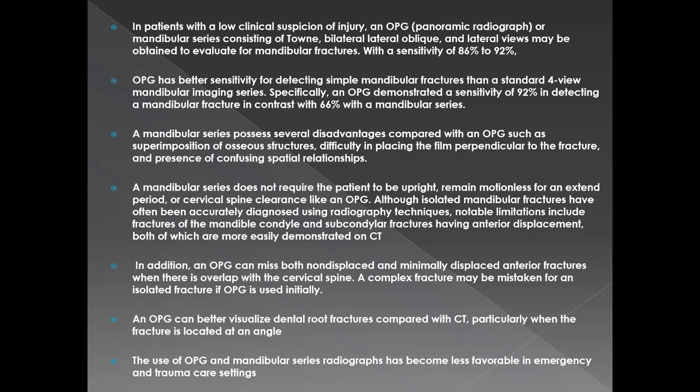Okay, a puff cheek view is basically... I don't know which edition of Contemporary or Tucker that you have, but I believe it was the 4th edition, if I'm not wrong. Yes, in the 4th edition, you will find this puff cheek view in the chapter on salivary gland diseases. Once I tell you, you'll be laughing at yourself that what sort of an X-ray is this.